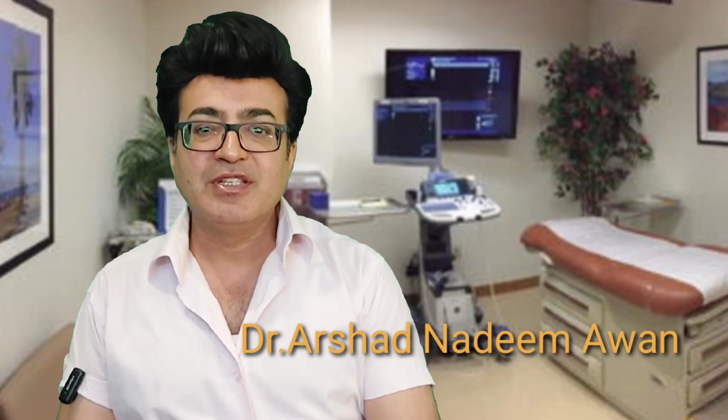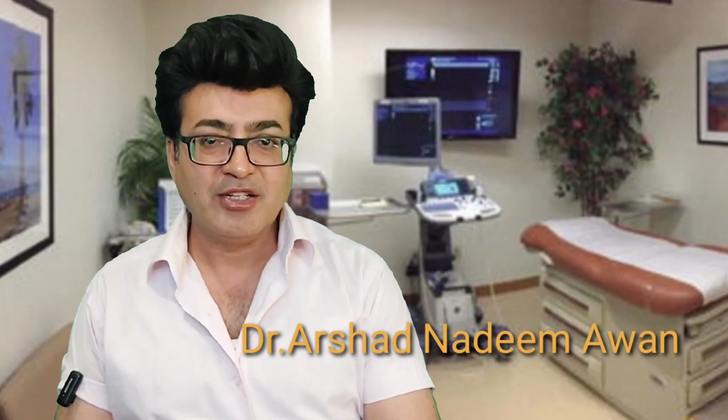Today my topic of discussion is cervical incompetence. It is a very important topic because the gynecological section, the gynae physician and surgeon, depend upon the ultrasound finding. And if you give them a proper and correct finding, it will help them to prevent the abortion. So that's why it is a very important topic.